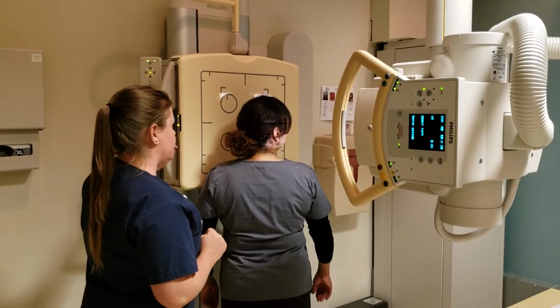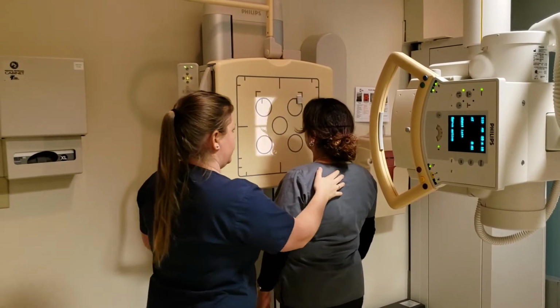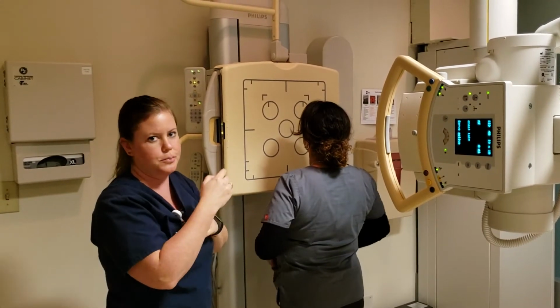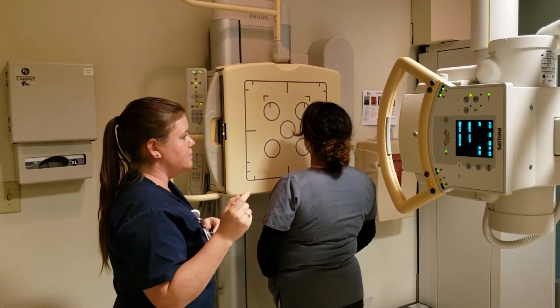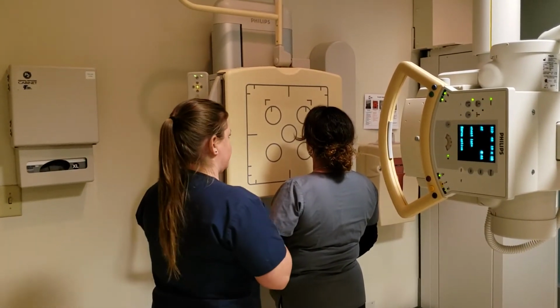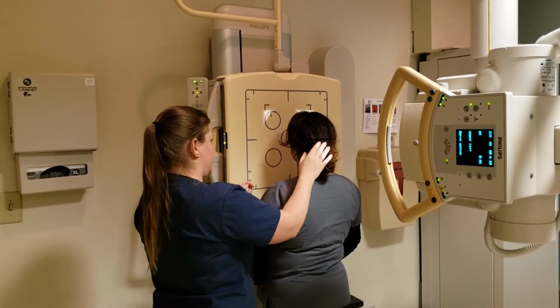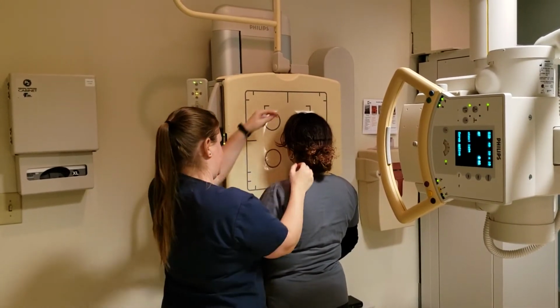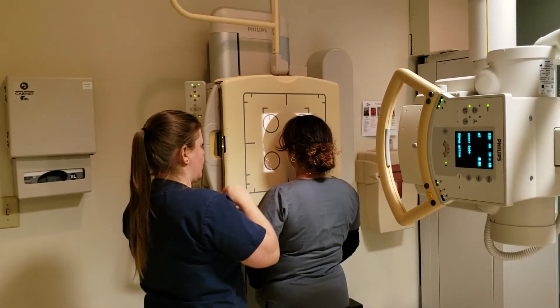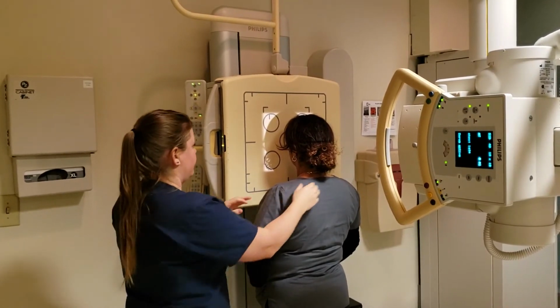And for the next one, I'm going to do the PA axial Caldwell. So I'm going to have you turn and face the board. Because it's a sinus, it's not really an axial then, since it's a horizontal beam. But they're all horizontal beams, so they can show the fluid level in the sinuses. So you're gonna step closer. The central ray is going to be exiting the nasion. Try to get your head down a little bit. And then there should be a 15-degree angle between the OML and the central ray. This one I'll do at 75 at 10.